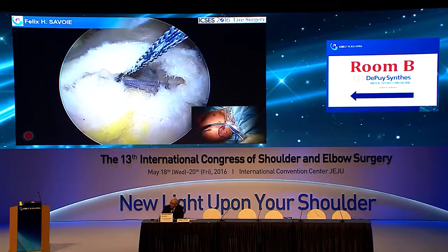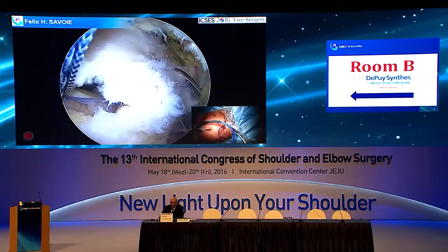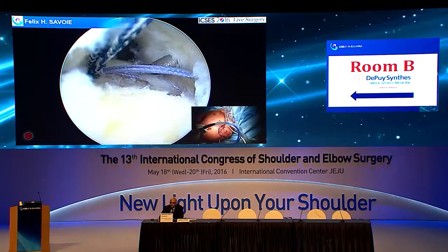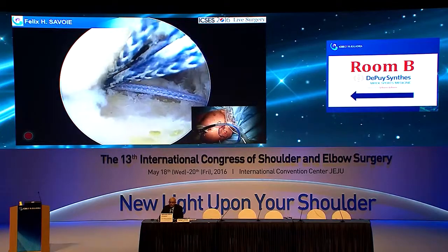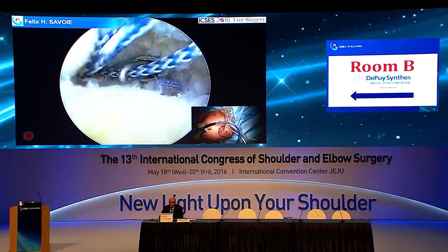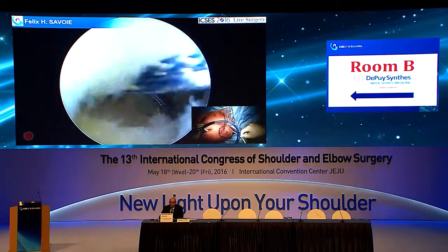Certainly, I can answer that question. What I'm doing is I'm going medial to the delamination, right? Yep. And if you look under here, I'm going medial to the entire delamination. I want to bring this undersurface part back to this medial part without changing my mismatch. So I'm going through the tendon obliquely so that I put those two together. And then we may double pass in a minute.